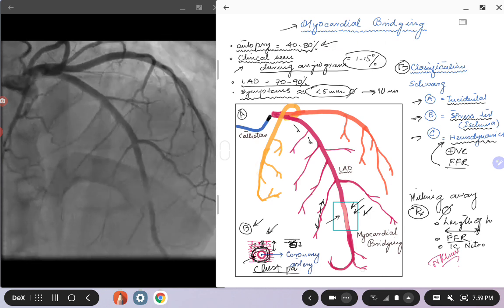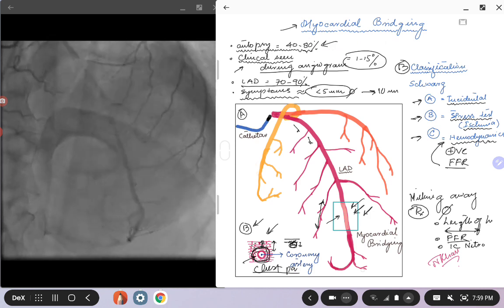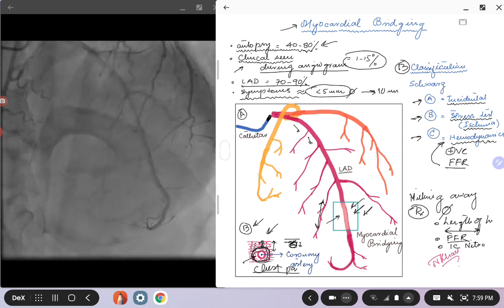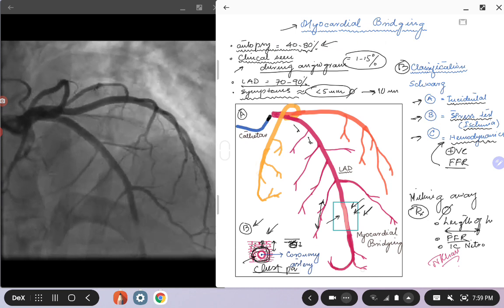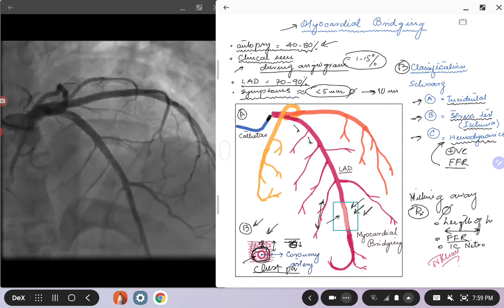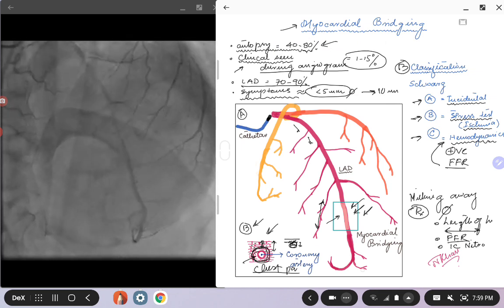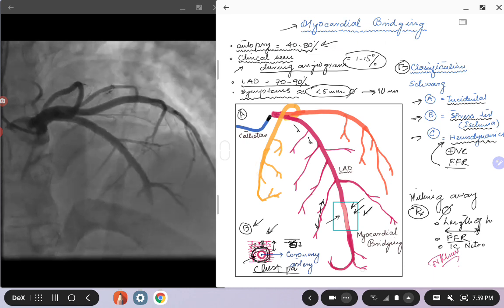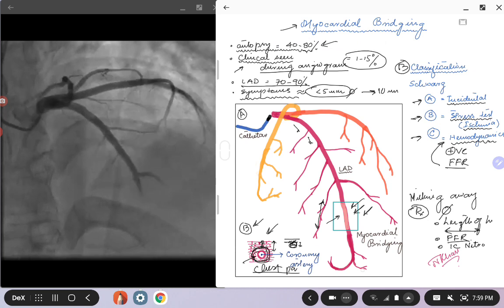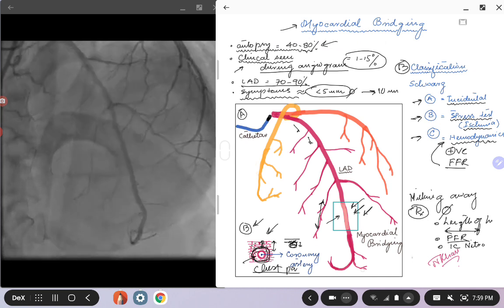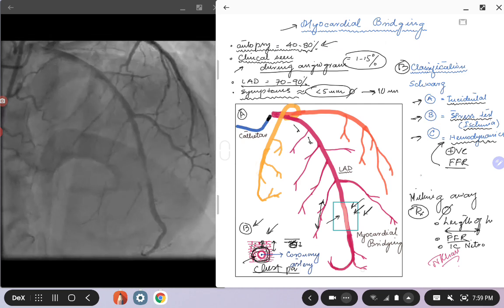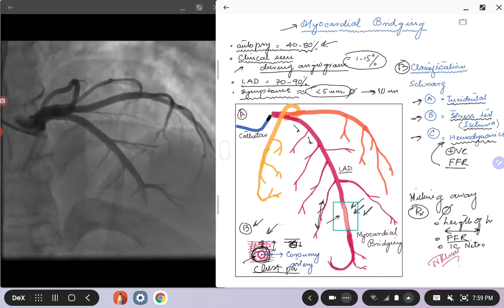You can also give intracoronary nitroglycerin to assess significance. What happens is that nitro causes shunting of blood into the normal arteries and branching vessels, somewhat depriving the myocardial bridging segment. Once you give nitro, the blood is shunted away from the bridging segment, which may make the compression appear more significant and help characterize the lesion.